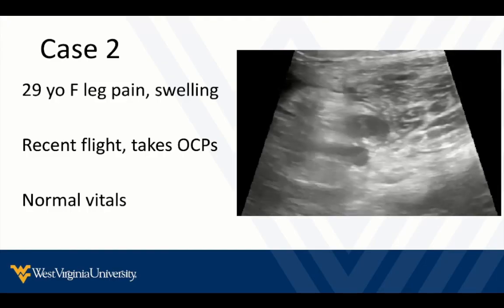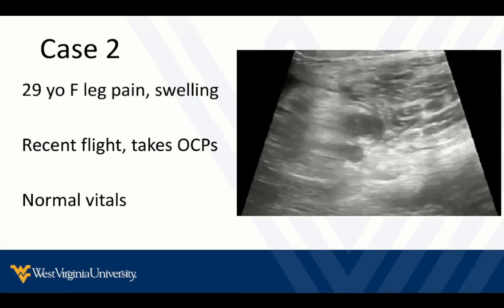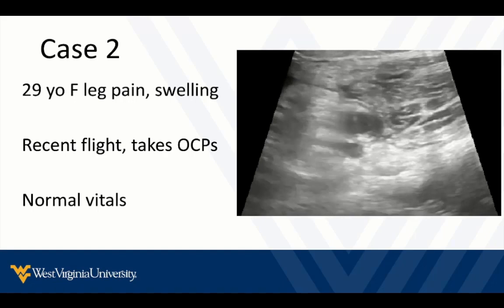So back to some of the cases that we talked about. This was our 29-year-old woman who looks pretty stable, but has some risk factors. Within about 5 minutes, we can look at this patient and say, yep, you have a DVT.